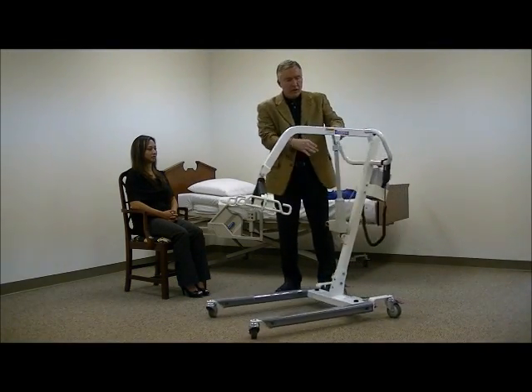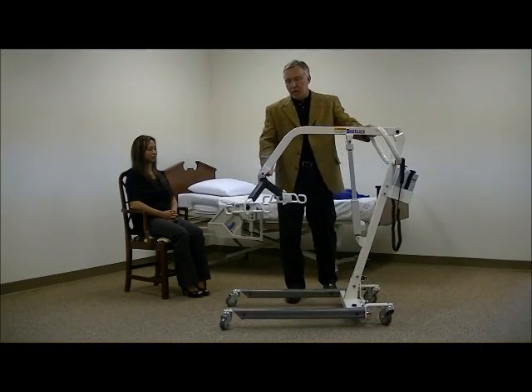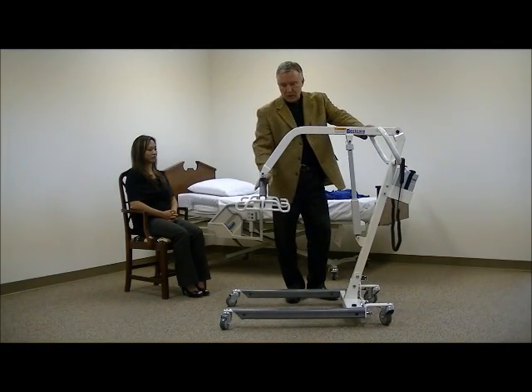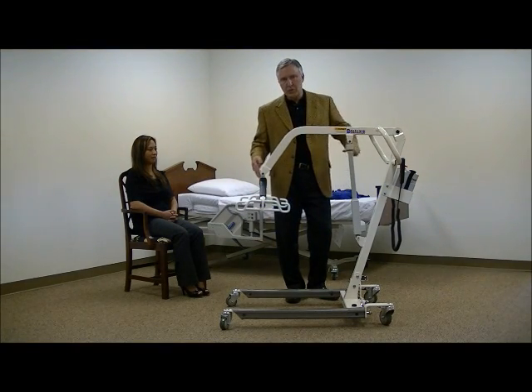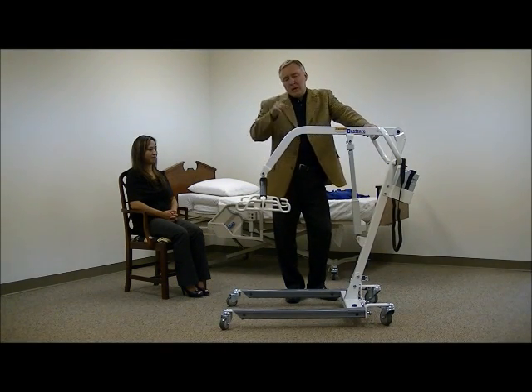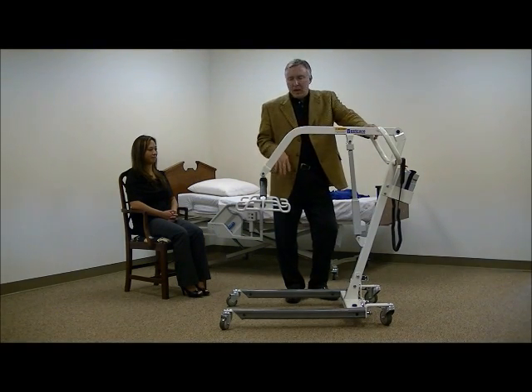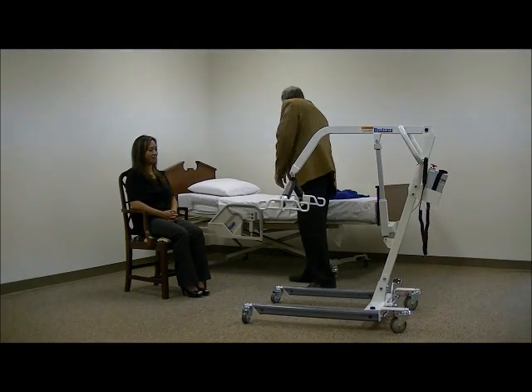So this little lift here is great for small spaces. As I was saying in an earlier video, it'll go down about this low here. You can see it's quite a distance from the ground, so it doesn't go quite as low as some of the lifts because it's shorter and smaller. It goes up in the air, but as you go up higher you get closer to the actuator, which makes it harder to rotate the person. It does the job though if you need a really small lift for a small environment.